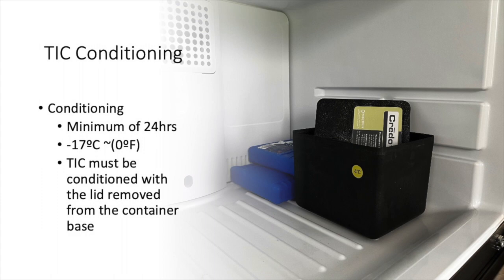While some TICs used in the region may say that the TIC is conditioned after 8 hours in the freezer, just keep in mind that for whole blood, all of our evaluations have been done utilizing a 24-hour conditioning time.